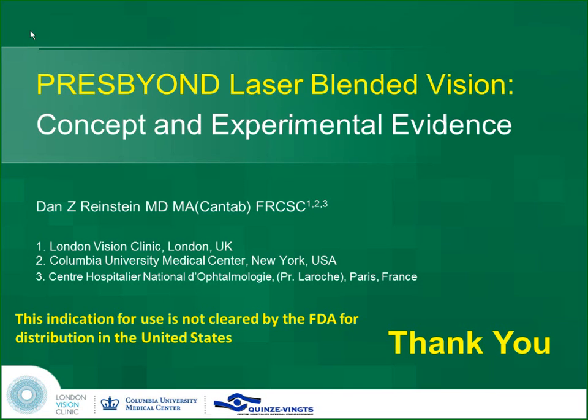It might be decentered. The retreatment might be a recentration. Yeah. But Tomita only recentered 1% of his patients, and yet 6% had more than 3 lines loss. It's 3 lines or more, which is a lot. And he's very experienced. I don't know. You'd have to ask him. Just for reference, I put the blended vision results at the bottom for you, just so that you can see. Absolutely.